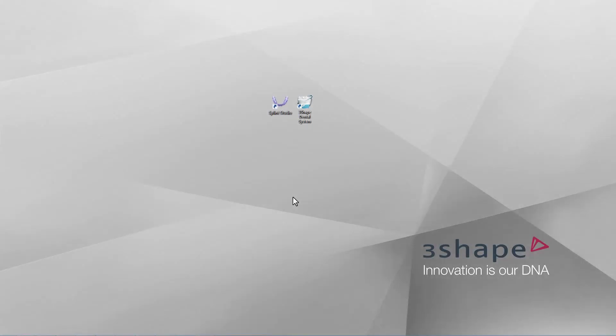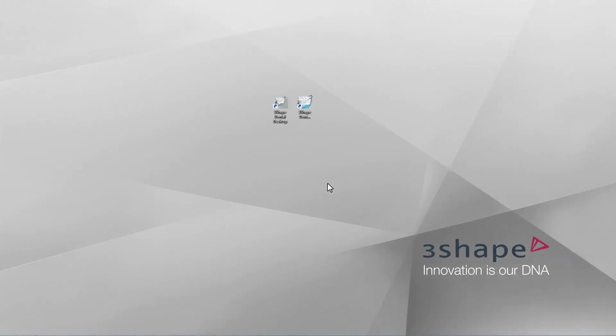The new Splint Studio exists in a separate application on the desktop, next to Dental System. It's the same software where you'll find Smile Design and Clear Aligner Studio, if you have these products. Please remember, an icon in your system could also look like this.